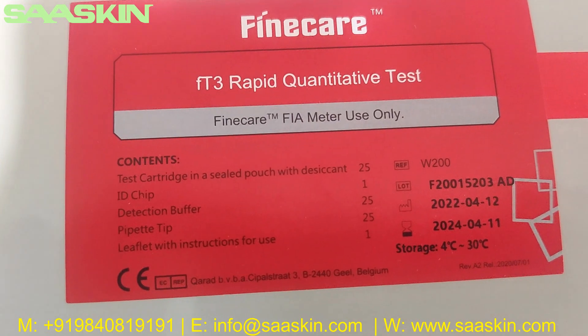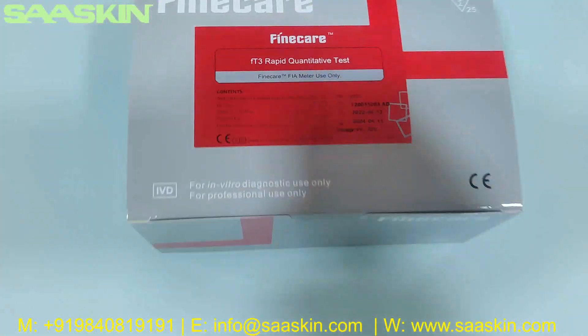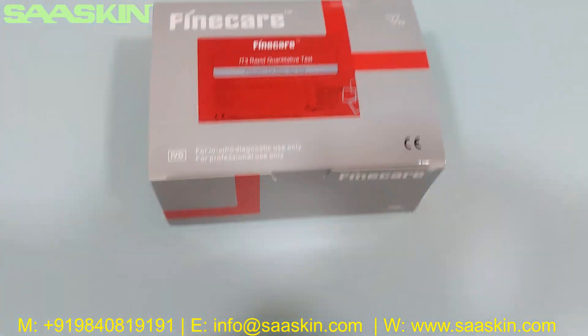You can see the contents listed here: 25 test cartridges, 1 ID chip, 25 detection buffers, 25 pipette tips, and a leaflet with instructions for use. Let me go around this box.